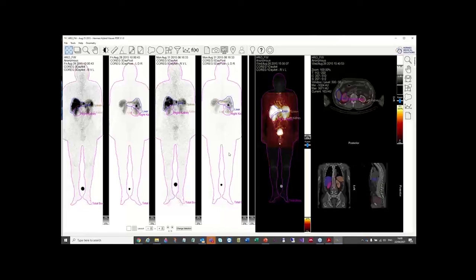Absolutely, yes. And in fact, our quantitative SPECT reconstruction of lutetium-177 was published in a paper recently, whereby Hermes, especially being an independent system, was more consistent than any other between different cameras. That's the quantitative reconstruction part. Yes, that's right. There was a really nice multi-center trial in Holland, I think.